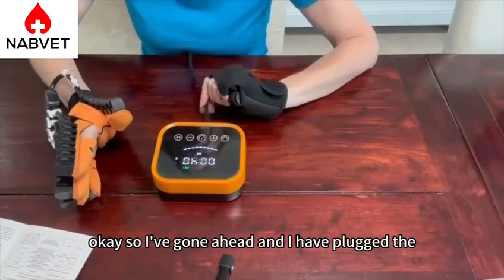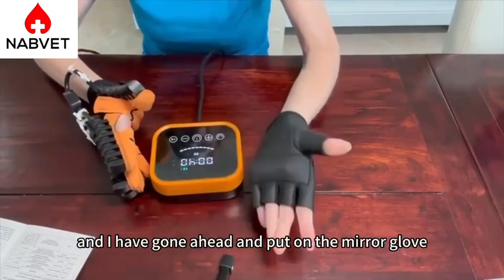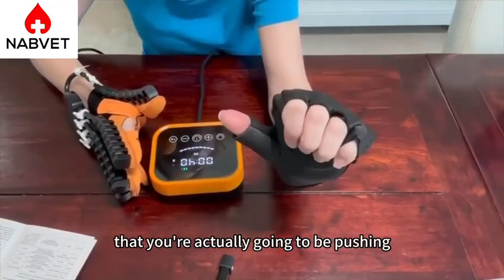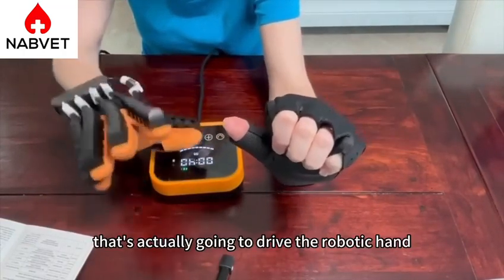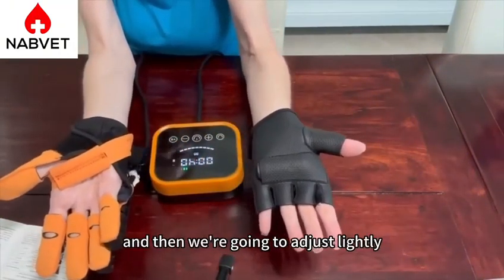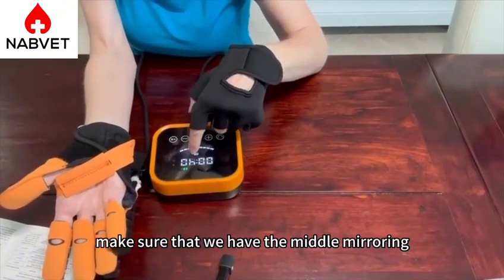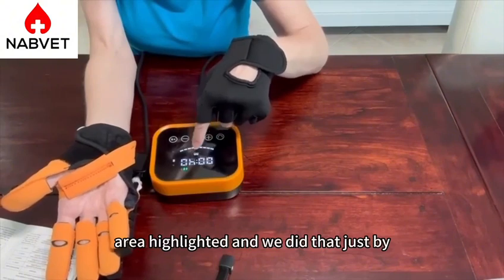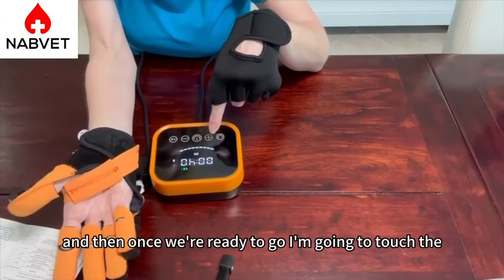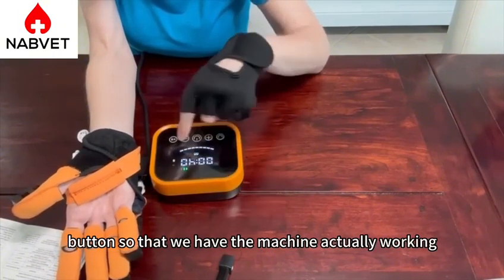I've gone ahead and plugged the robotic glove into the host and put on the mirror glove. The mirror glove actually has a sensor right here that you're actually going to be pushing, and that's actually going to drive the robotic hand. The first thing you want to do is make sure that you have your hands in the open position, and then we're going to just lightly make sure that we have the middle mirroring area highlighted. We did that just by changing the setting right here, and then once we're ready to go, I'm going to touch the button so that we have the machine actually working.